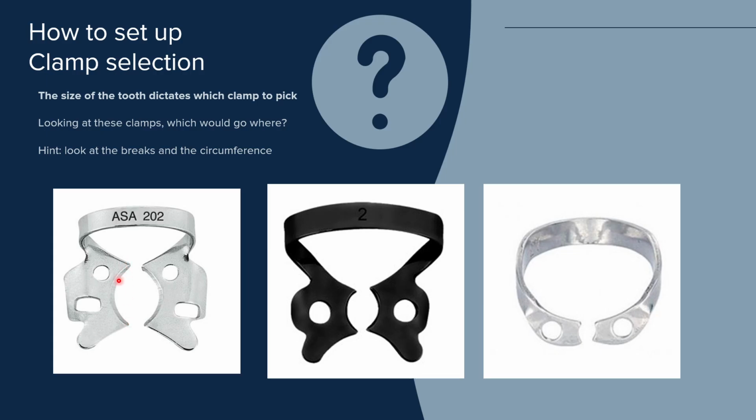It's almost like you can fit a double tooth or a molar. This is a little shorter, but still nice and round. You can fit sort of a premolar in there. And then this here is very tiny. This would be for an incisor. So molar, wide beaks; premolar, narrower; incisor, narrow.